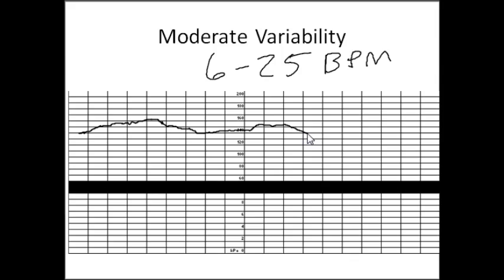Maybe it'll go kind of down a little. But over the long run, you're kind of hovering around that 140 mark. Really, our beats per minute don't fluctuate too much, and we're not going off the graph paper, but you're able to see kind of the progression. For the first 5 minutes or so, we're slowly increasing the baseline, but maybe later on, the baseline may normalize, so over the long run, our baseline is changing. All right, let's clear this.